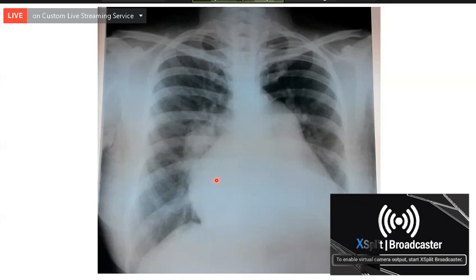So pulmonary plethora is diagnosed by: one, end on vessels more than 5, both sides together; two, one side only more than 3; three, the vessels can be traced to the periphery; and four, enlargement of the main pulmonary artery, with left and right pulmonary arteries also enlarged. End on vessels are the characteristic feature of increased pulmonary plethora. So is this patient having pulmonary plethora? Yes, this patient has pulmonary plethora.